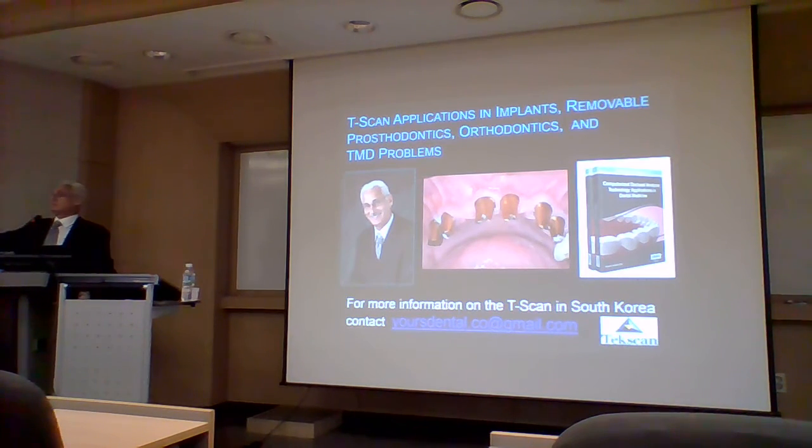You need to know where there's too much in your mouth and where there isn't enough, where it's concentrated, where it's extra. You don't need to know that it actually is 100 pounds per square inch there and 75 over here, right? So the T-scan makes that very simple for you. But there are people who want the raw data for research purposes, and that's where they would either get the ASCII add-on or buy an iScan. An iScan is 3 times as expensive as a T-scan.